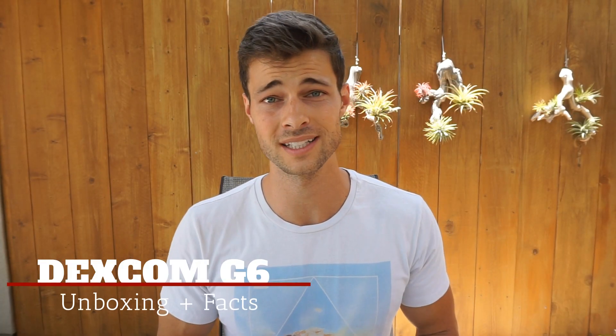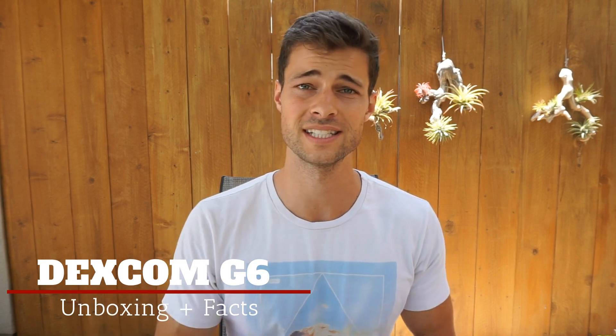Alright, what's up warriors? So today I am going to show you the unboxing of the Dexcom G6 CGM.